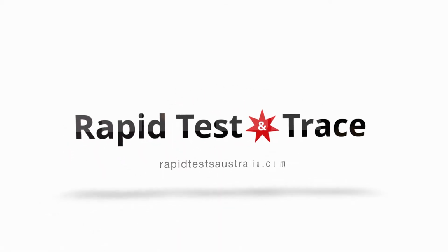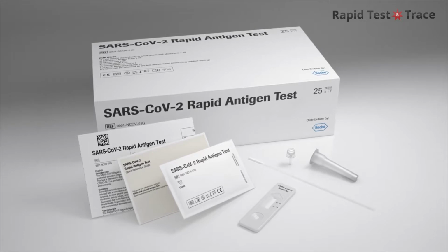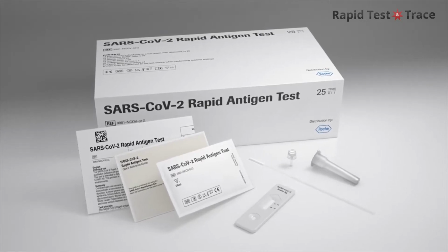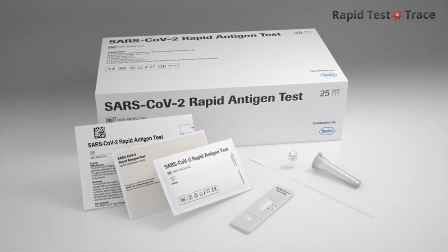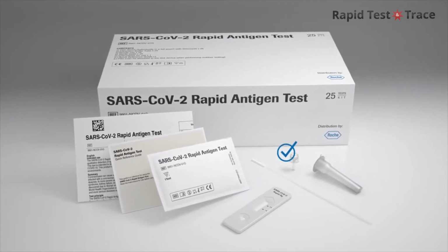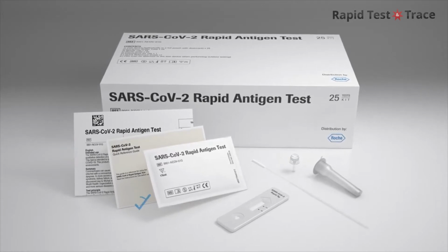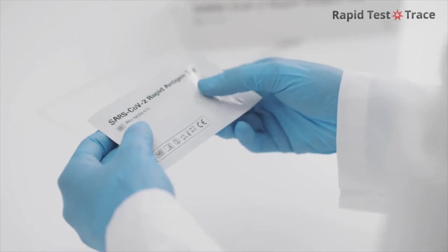This is a tutorial on how to administer the rapid antigen tests sold by Rapid Test and Trace Australia. While we offer a variety of tests through our website, the process of using the tests is generally very similar for each manufacturer. To catch infections, antigen tests look for molecules on the surface of the virus.